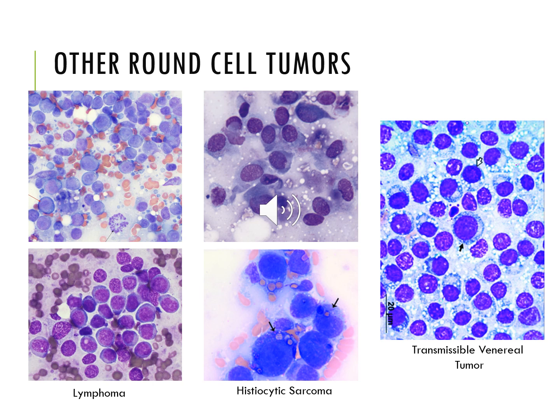They have open chromatin. They have nucleoli, multiple nucleoli sometimes throughout. They have a more basophilic rim of cytoplasm. They're very large. They should be about the size of a red blood cell to maybe 1.5 times the size of a red blood cell. And you can tell that these are just significantly larger than that. And then there's actually a mitotic figure in the bottom part of that image.